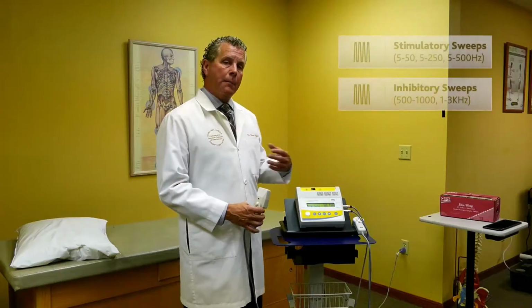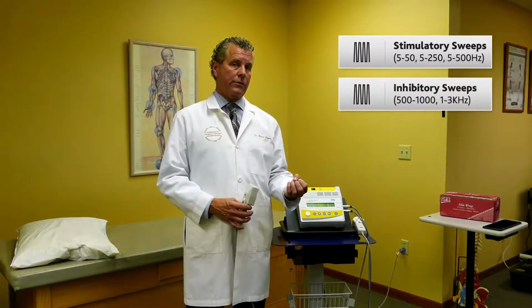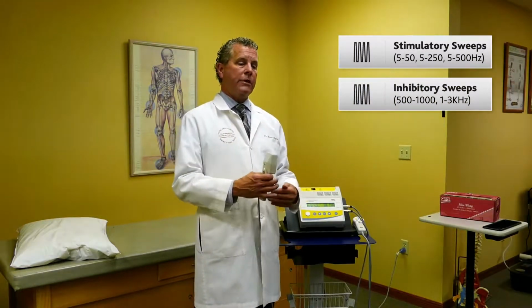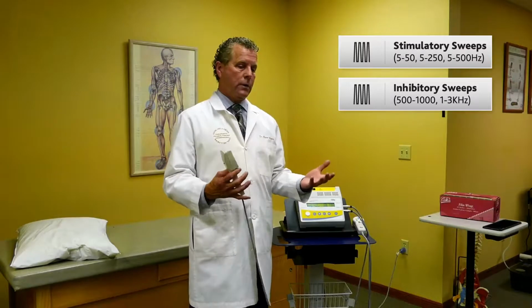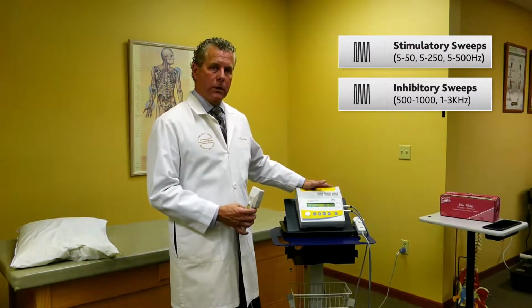In my practice, I predominantly use sweep because I have found clinically I get faster results, and this is something I have determined over the years of treating hundreds, if not thousands, of patients. So again, I like to use the sweep mode.